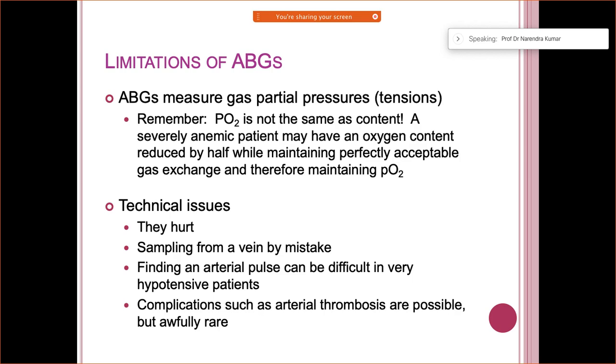Similarly, I don't like to take needles on my body, so it definitely hurts the patient as well. What about if you do the sampling from a vein by mistake, and if a patient is hypotensive, it can be difficult. Similarly, complications can happen, like arterial thrombosis. Those things can happen, so we all have to be careful.